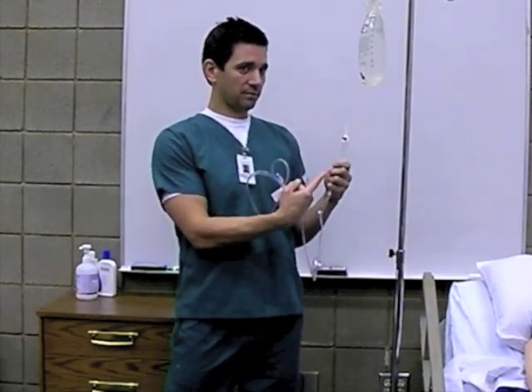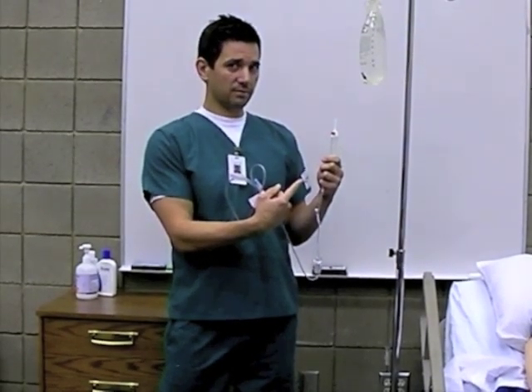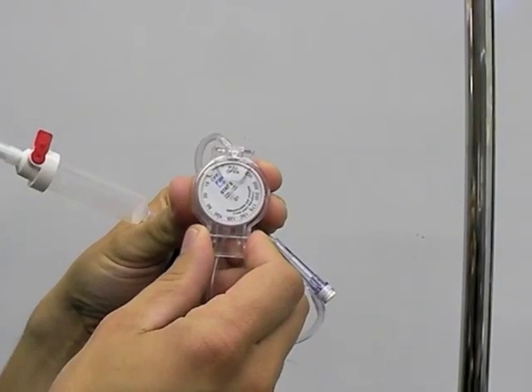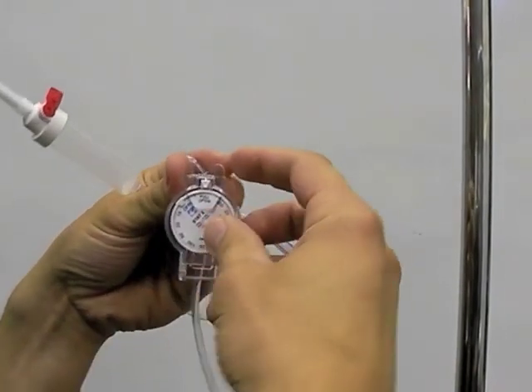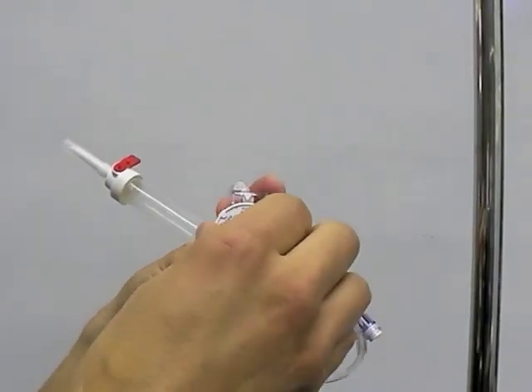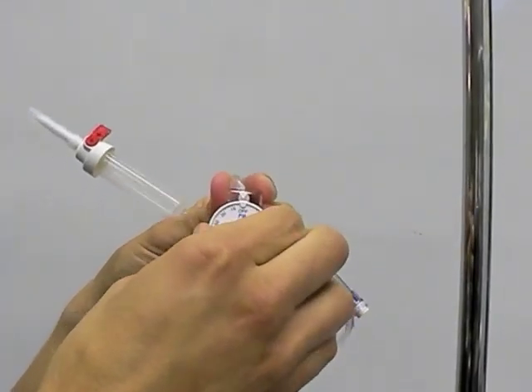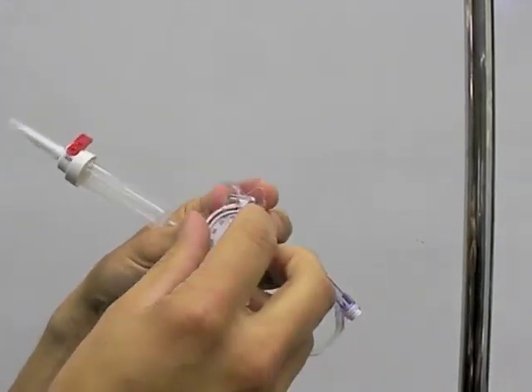The spike and the drip chamber are located on the end of the administration set, which will be inserted into the IV bag. Before we spike our bag of saline, we need to occlude our line by setting our drip rate to off. This prevents us from making a mess when we spike our solution. With an open line, we could have saline leaking all over the floor.